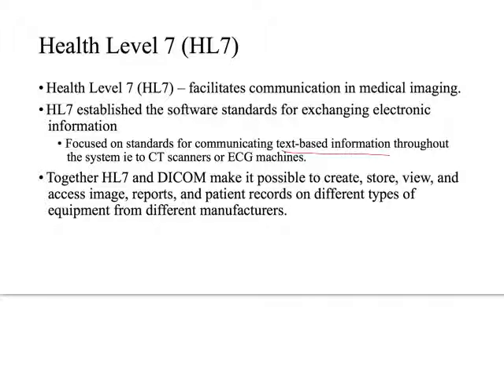But together, HL7 and DICOM are what makes it possible to create, store, and view images from a bunch of different kinds of manufacturers. So it operates independent of who made the imaging equipment.